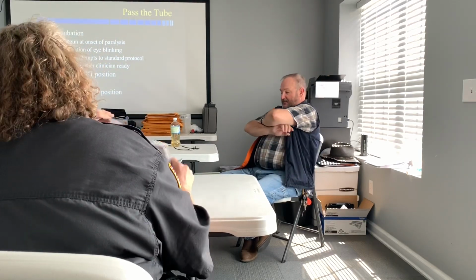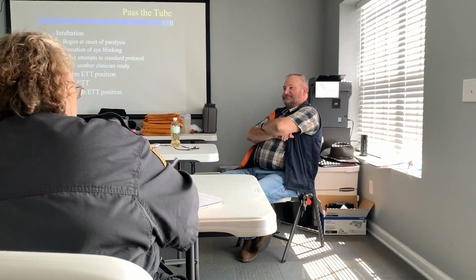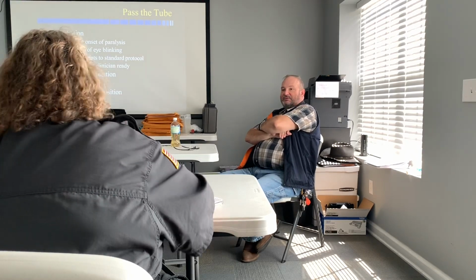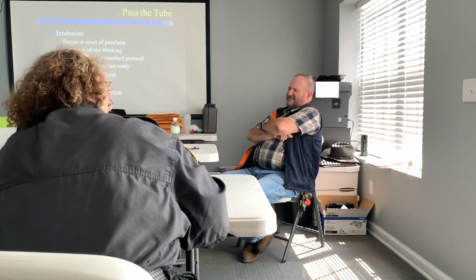Okay. So finally, after all this time, we get down to pass the tube. So when do you know he's ready? When he doesn't have a gag reflex, try the blink response. See if you rub his eyelashes and see if he blinks. If he has a blink reflex, he's probably got a gag reflex. That's not 100%, but more often than not.